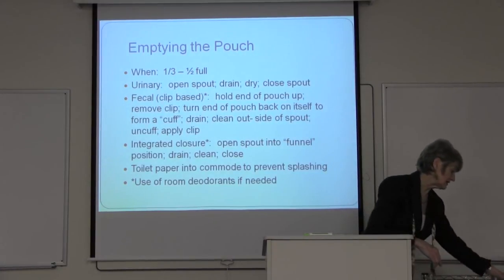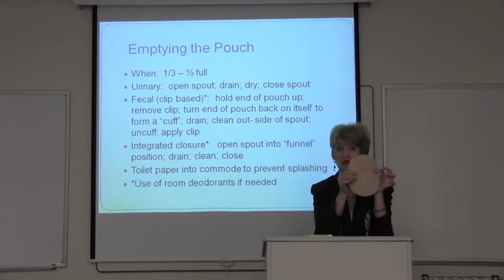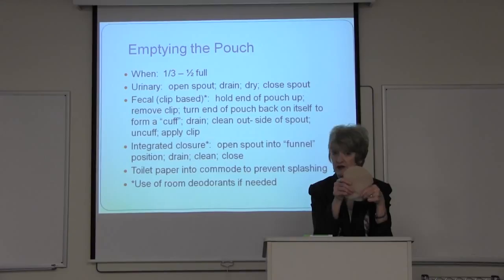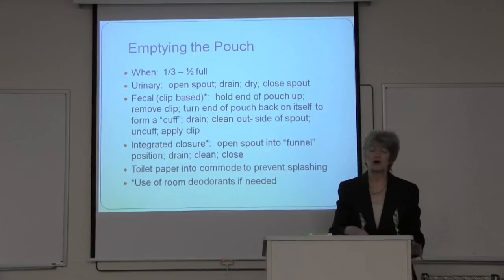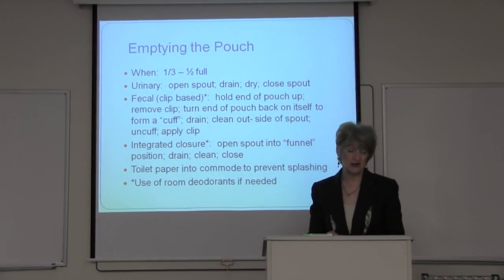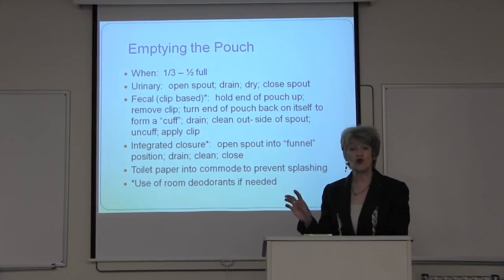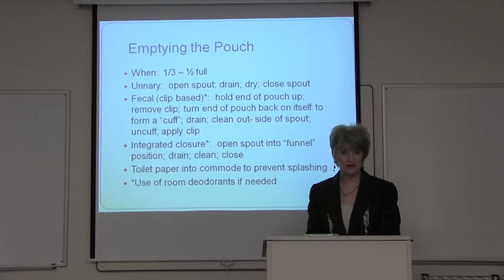What we usually find is that once we switch patients into opaque pouches, they don't feel as much need to rinse. It's when they look down and see stool that they feel the need to rinse. So moving them into opaque pouches, once they're comfortable getting their pouch lined up correctly, can be very beneficial to them, makes them much more comfortable, and eliminates that sensation that they need to rinse for most patients. Also, you should notice that if you teach patients to put toilet paper into the commode before they empty, it reduces noise and splashback.